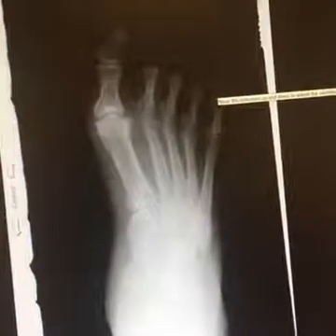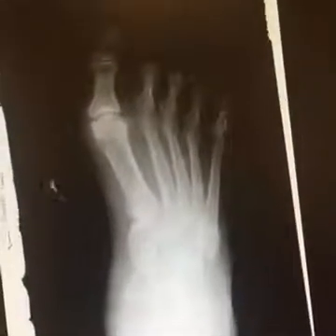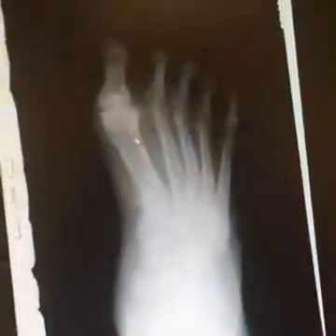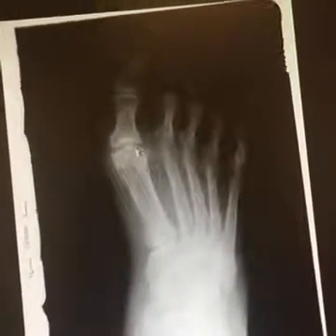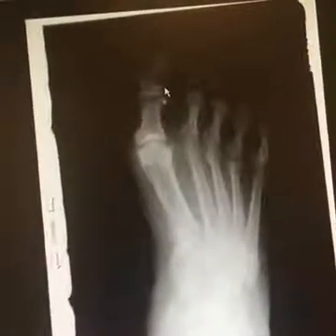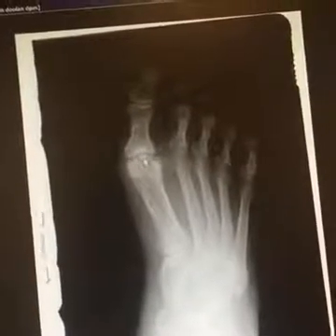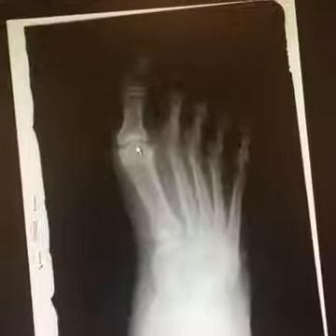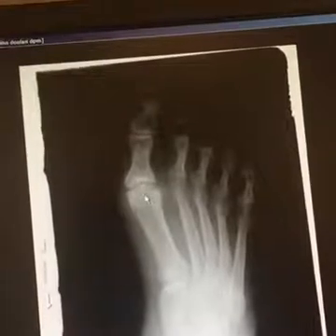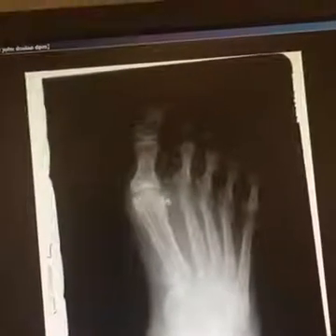Here is the next x-ray. We can see very clearly that this patient has a slight bunion. Note that this x-ray is a little oblique — it should be straight on, and I did not take this x-ray. This joint is very narrow, so this patient will be experiencing some hallux limitus, some pain in their first MPJ. They most likely have what's called crepitus — a sign of arthritis, that rice-crispy grinding of the joint. Their sesamoids are in alignment, but again this is an oblique view so we're not looking at it straight on.